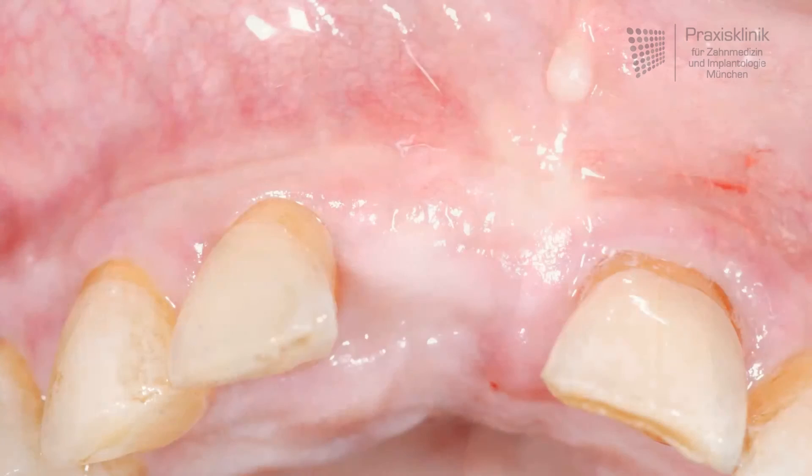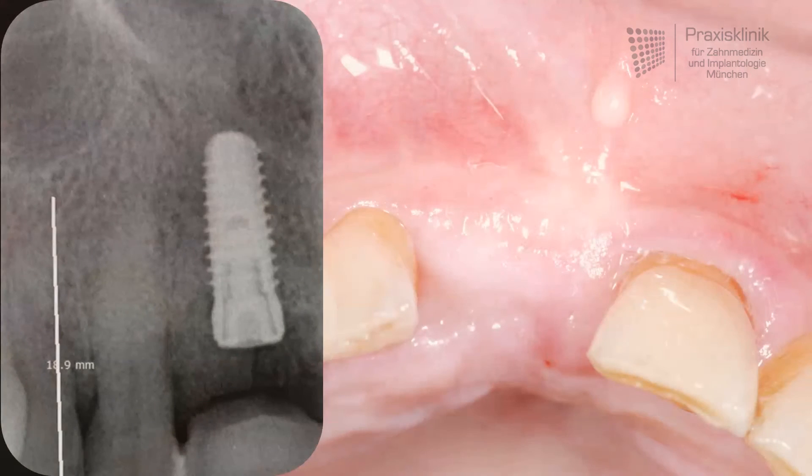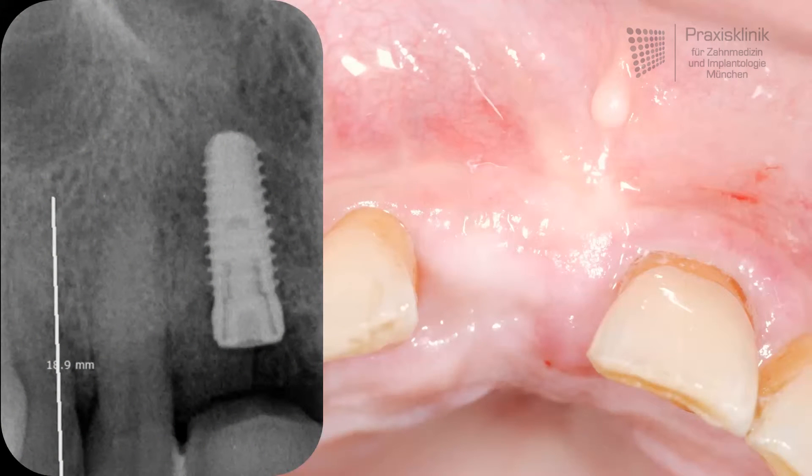After a three-month healing period, when we take a look at this picture, it is hard to imagine that there has been a bony defect of this size and geometry as we have seen before. Now everything is prepared for having an implant. As we can see in the x-ray image, the implant is placed in a good position.